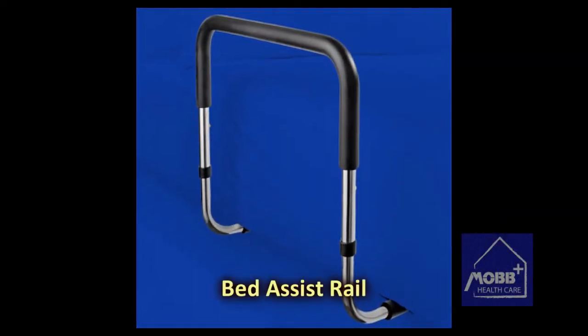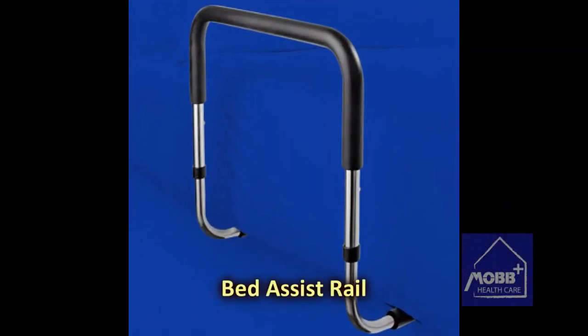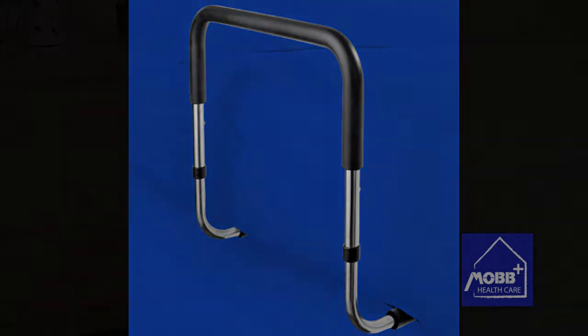Mob Home Health Care's Bed Assist Rail is an innovative design for people who require a little help for moving, standing, and transferring in and out of bed.